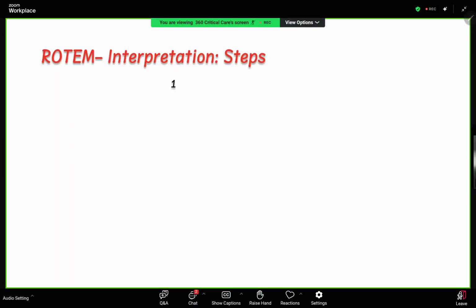Okay, now interpretation. So first step, what you do is to check for a heparin excess. If the patient is on heparin infusion or the patient is on a CP bypass, suppose in between CP bypass the anesthetist comes with a sample of blood to see in those cases. So what happens is in heparin excess you will have an INTEM clotting time more than 205, but this gets corrected in HEPTEM. So the clotting time will be higher in INTEM, but it gets corrected in HEPTEM. What does that mean? It is heparin excess. So what you will do is to give protamine just to reverse it, right?